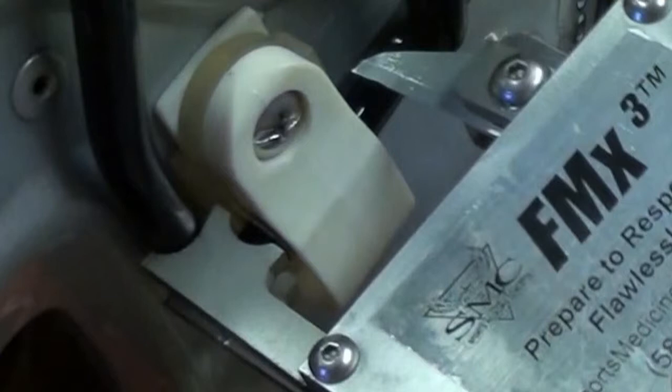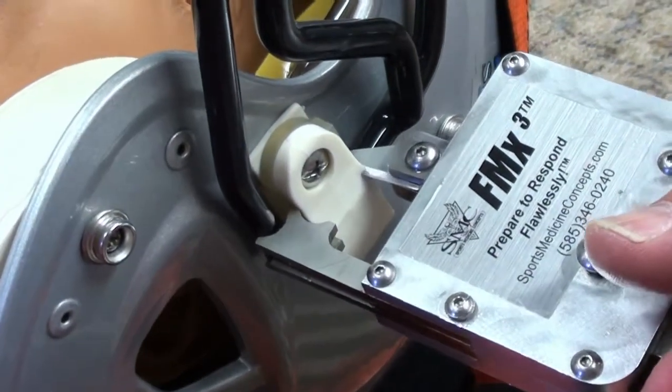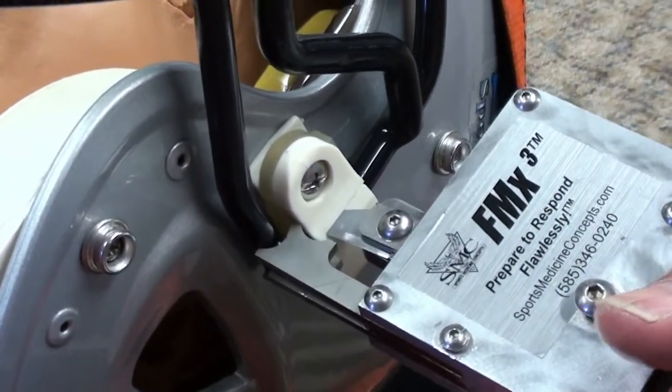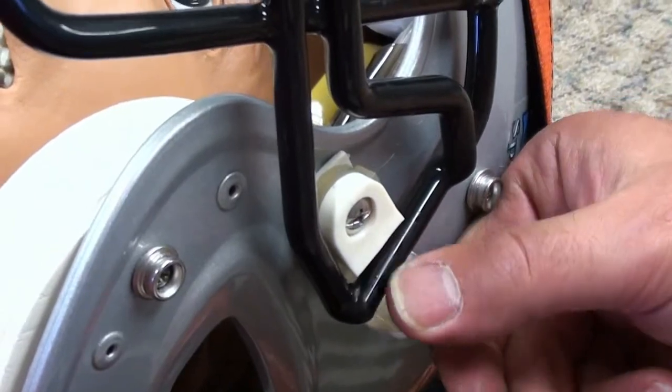Leaving the anvil in place, rotate the blade of the FM Extractor away from the helmet shell and press the release lever to disengage the ratchet and open the jaws of the FM Extractor. Next, use your thumb to pull the top two layers of the shock blocker out of the way.